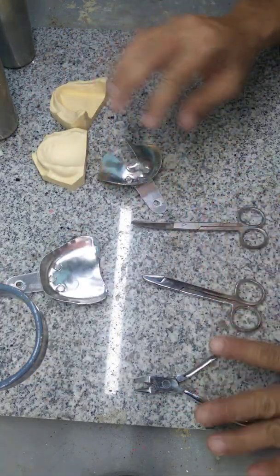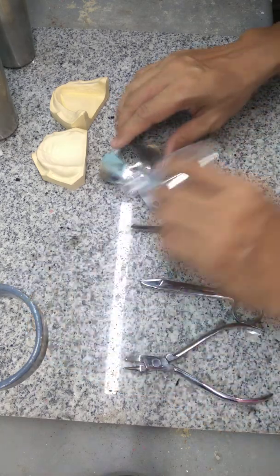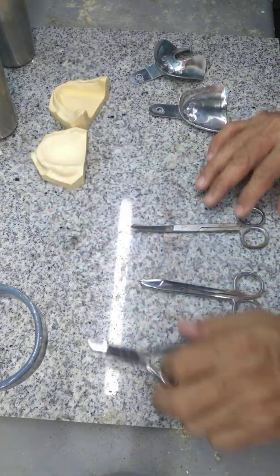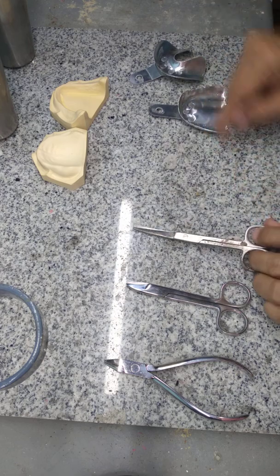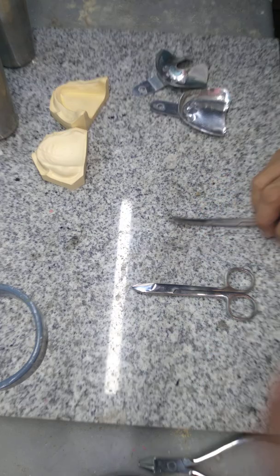The other instruments we're going to use for this activity are your plier, prosthetic scissor, or any other scissor that can cut your aluminum tray.